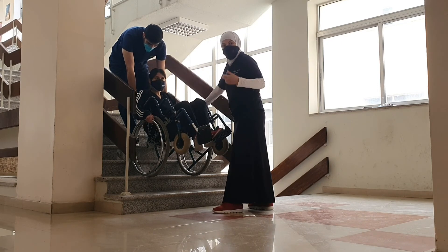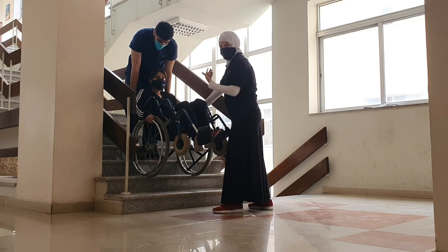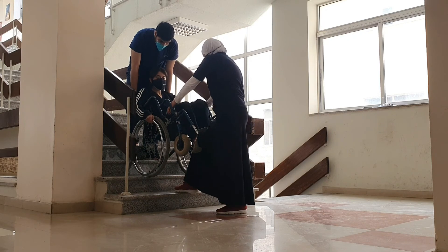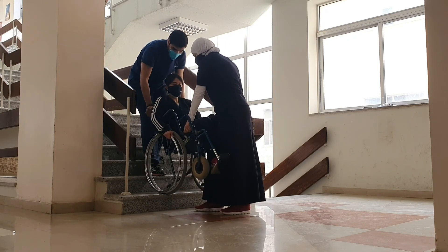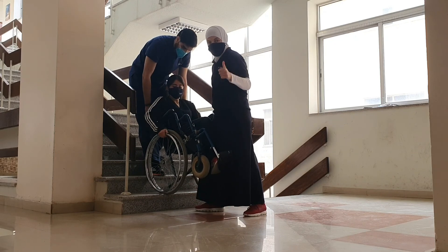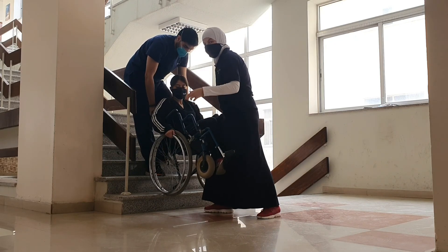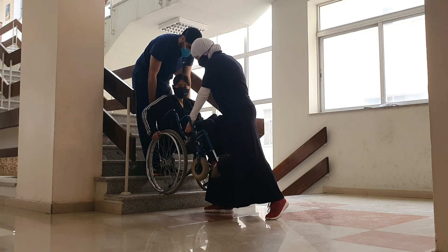To go down the steps, we reverse the sequence. The person is now facing down the steps, and we count: one, two, three, and move down one step. We then reposition — the front person repositions, the rear person repositions — and when everyone is ready, we do the count again: one, two, three, and continue down one step at a time.